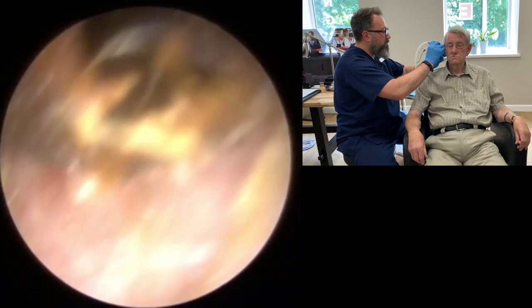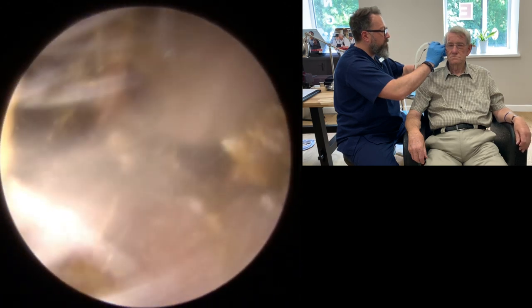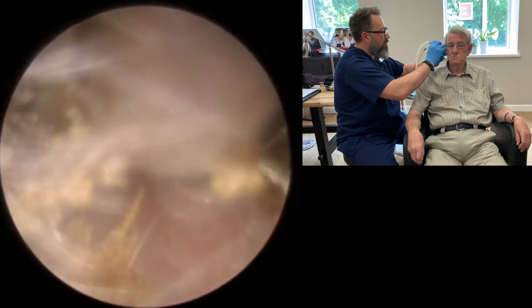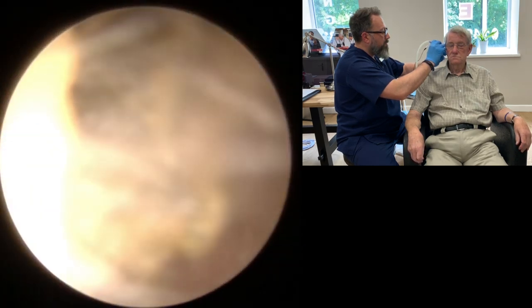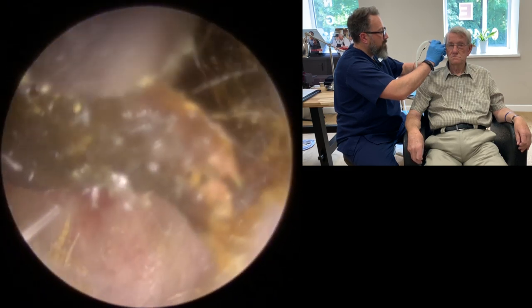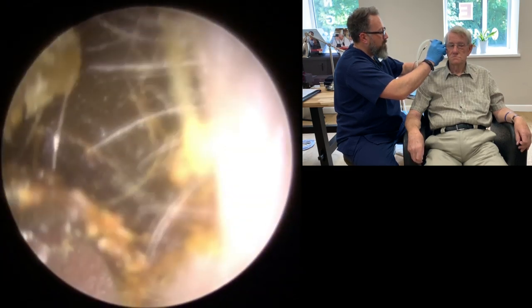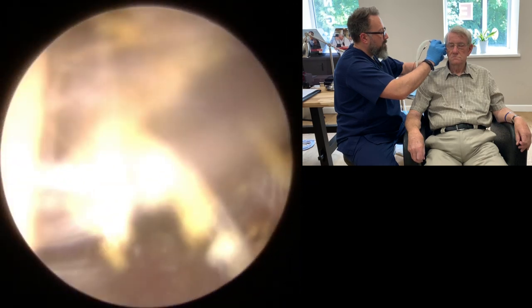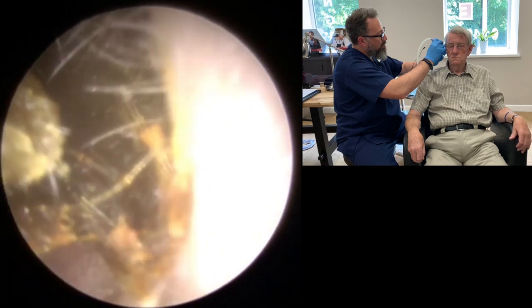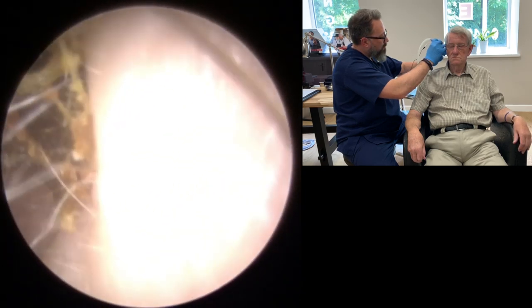You can see, trying to prop the canal wall open here with the suction tube, which is why we're so close to the wax in this shot, is because we're kind of holding the canal wall open using the endoscope and the suction tube there. You can see how sticky it's really kind of wedged and stuck in this ear canal. Starting to come away now though.